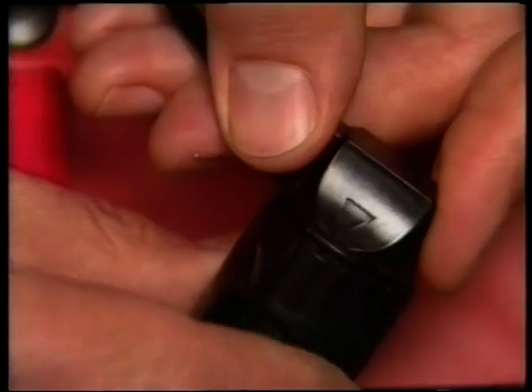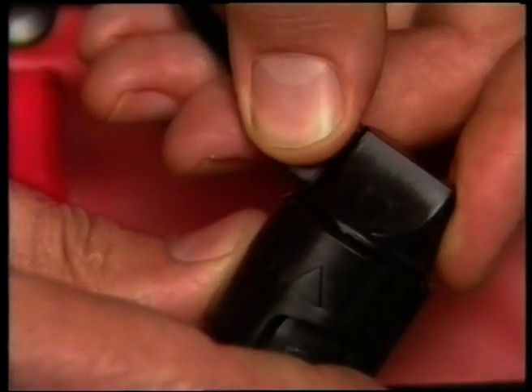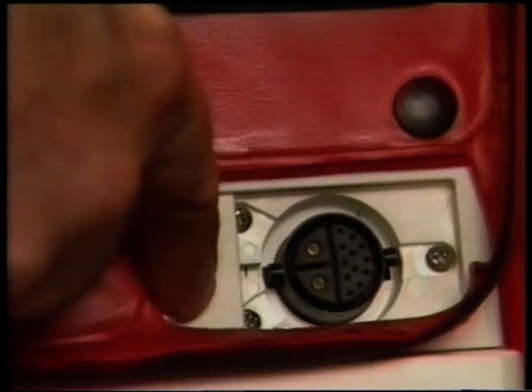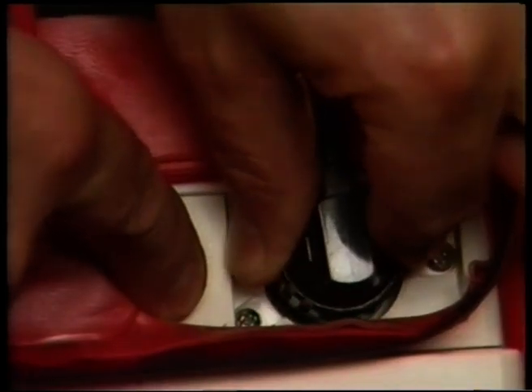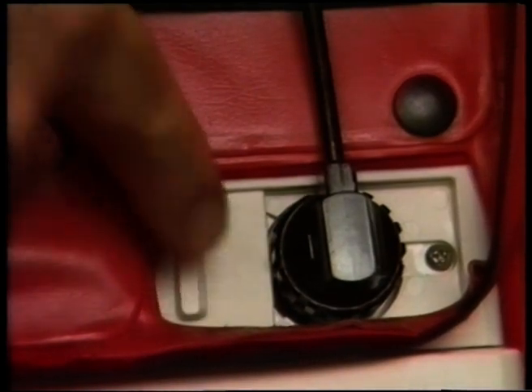Now install the 3-lead ECG cable by first lining up the 2 arrows on the connector. Hold open the connector slide door with one hand and push straight down on the connector with the other hand, orienting the connector as shown. Twist the outer lock collar clockwise to lock in the connector.